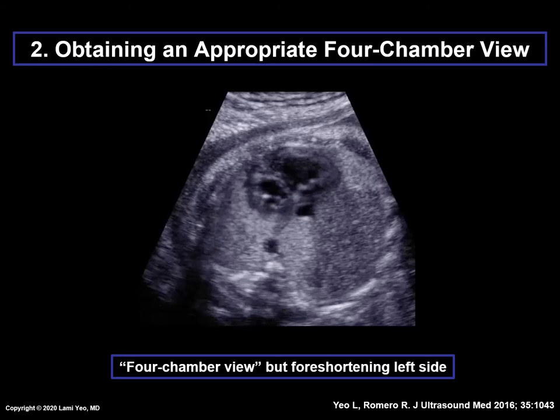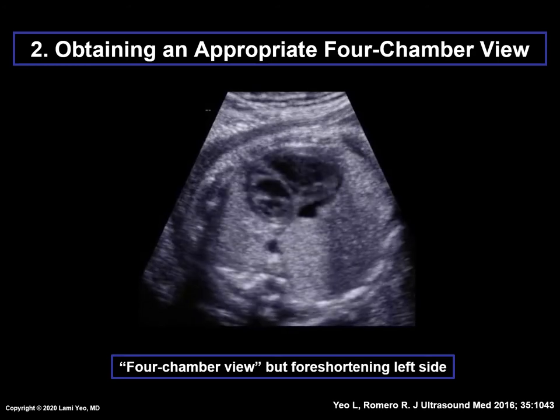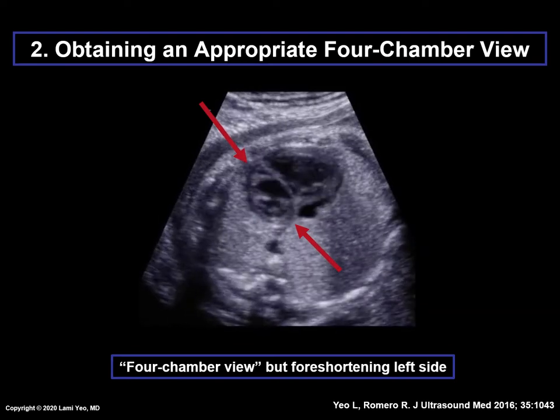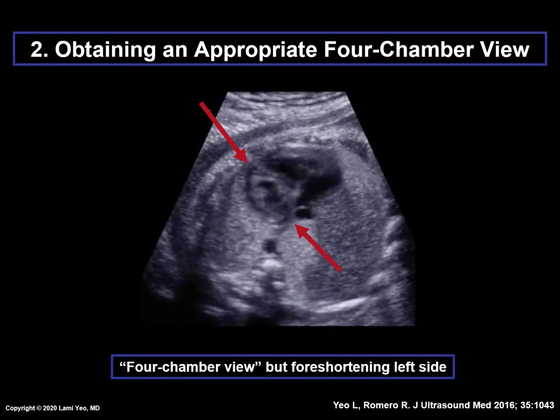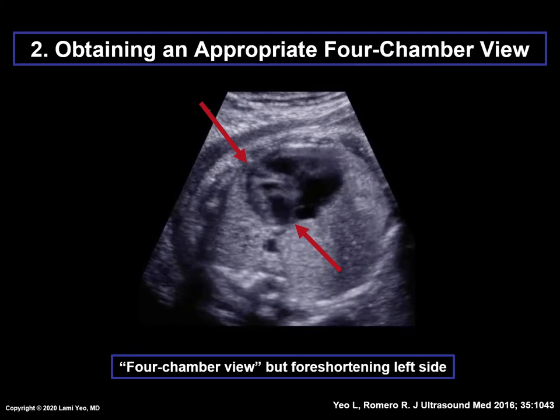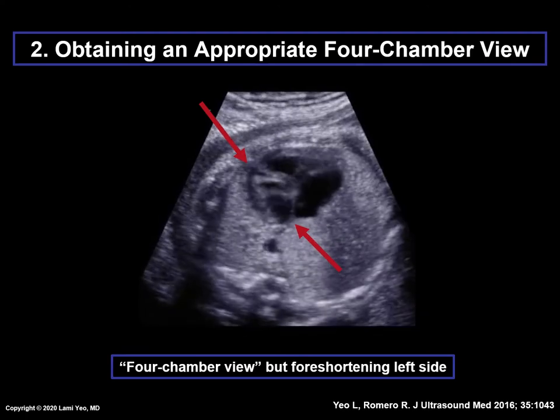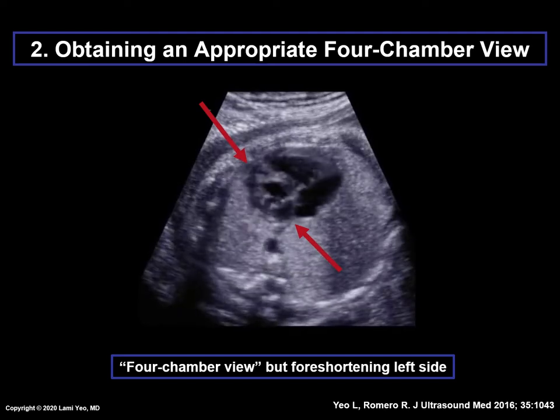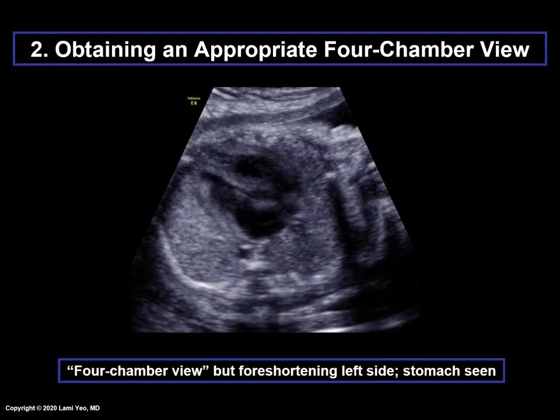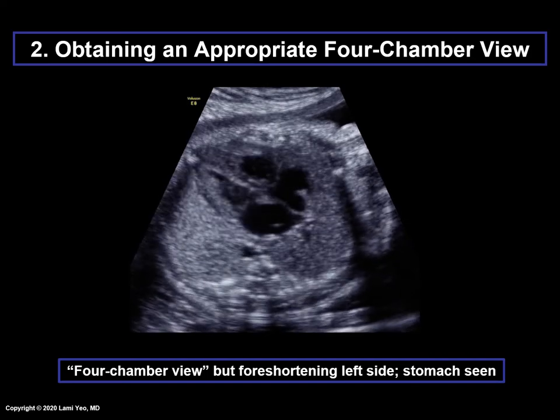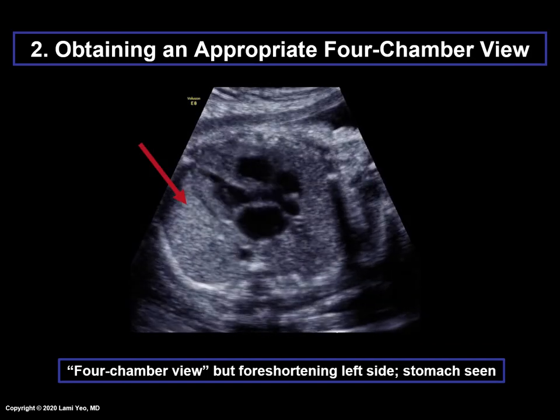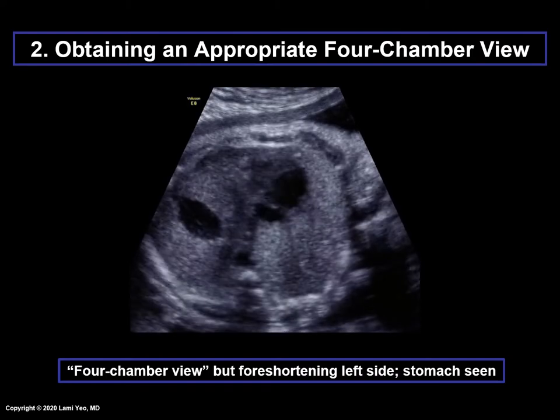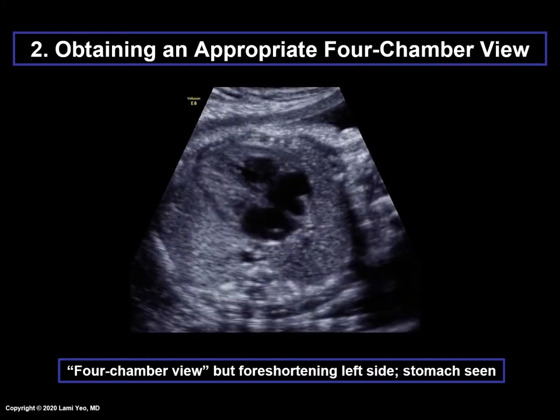Here is a four-chamber view of the normal fetal heart, but notice that the left side is foreshortened or appears cut off. Sonologists frequently tend to foreshorten the left versus the right side of the fetal heart when imaging the apical four-chamber view to acquire a STIC volume. If this occurs, the transducer should be tilted and readjusted so that there is symmetry of both the left and right sides of the heart. If the left side is foreshortened and the stomach is also seen, this cannot be a true axial plane, because the stomach can never be seen in the same plane as the fetal heart.